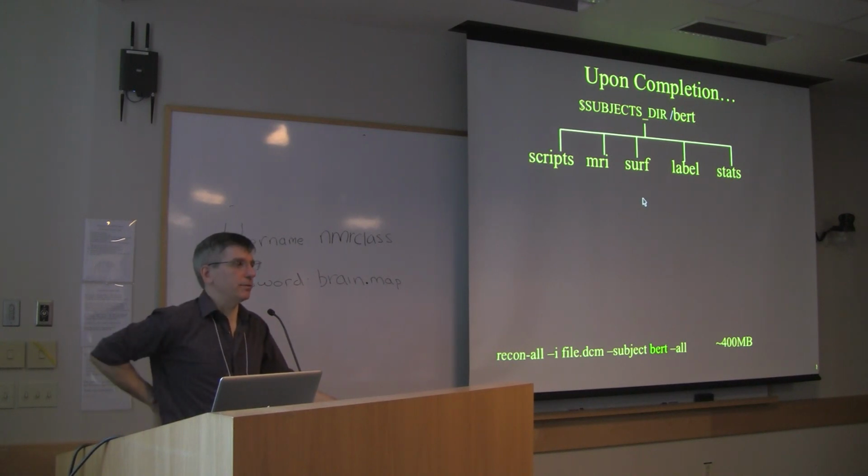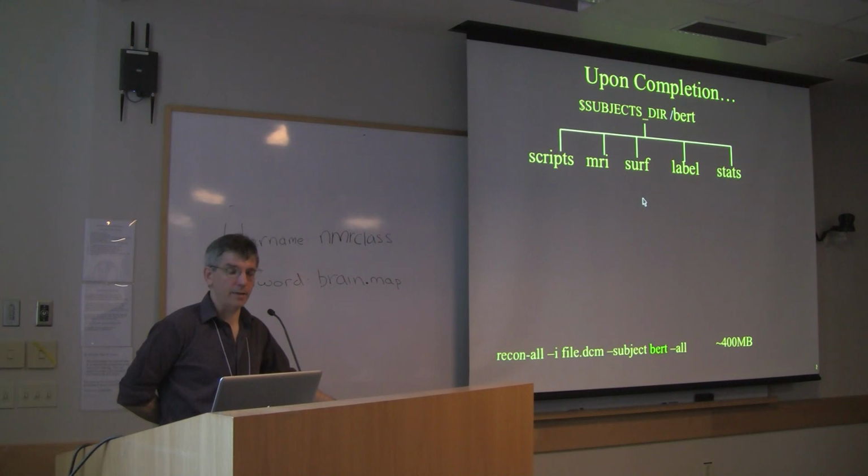Upon completion, as I said before, it's going to create this directory structure. Again, it's going to put everything into this subject dir folder under whatever subject name you happen to give it. So we have bert here. If you were to look inside of this folder, you would see a whole bunch of subfolders, and I'll only go through 5 of them here: scripts, mri, surf, label, and stats.